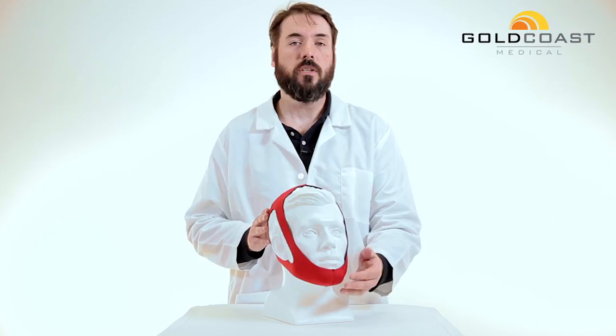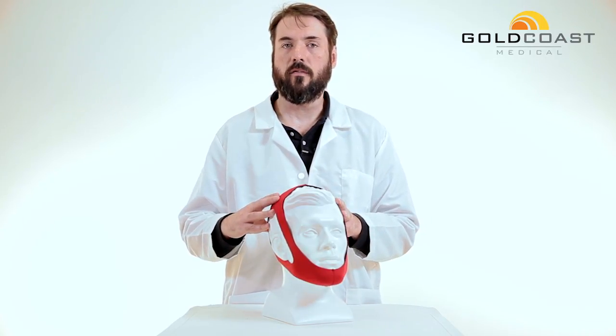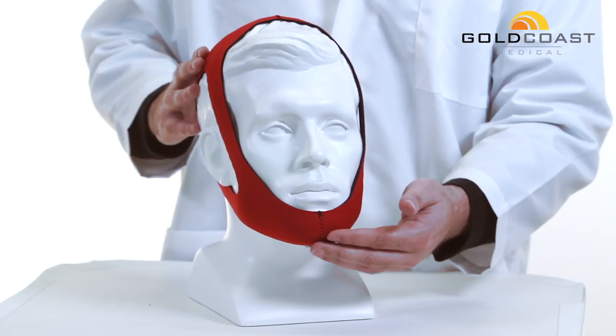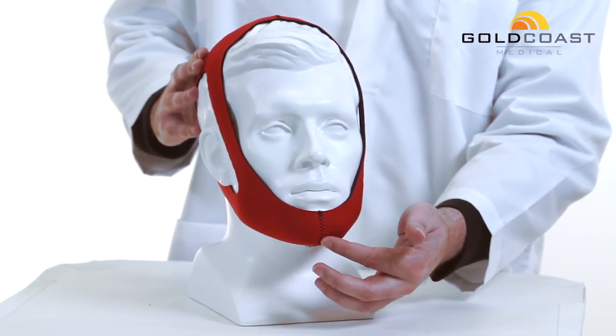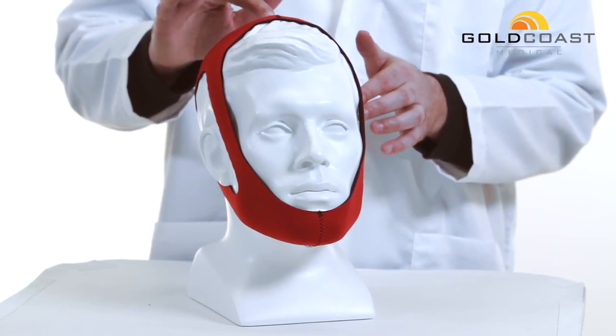These chin straps are non-adjustable, so you'll need to take some measurements in order to select the correct size for you. In order to measure, you'll place the tape measure at the bottom of your chin, measure up towards the ear and to the top of the head.